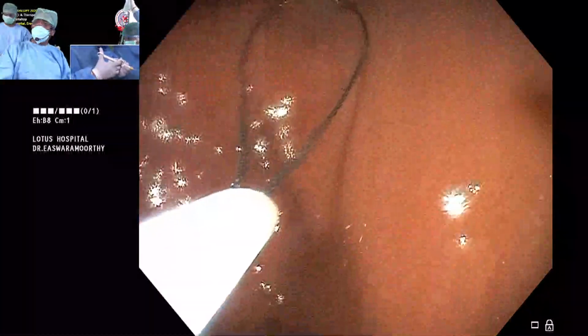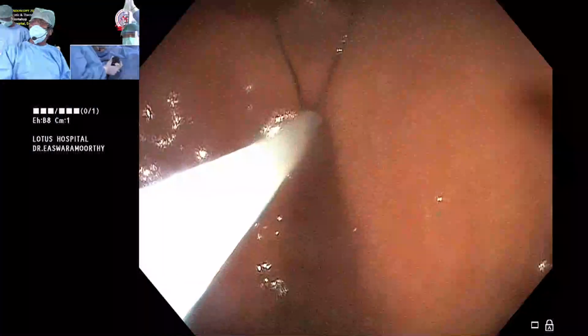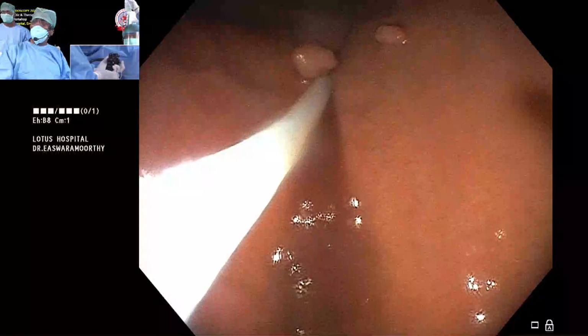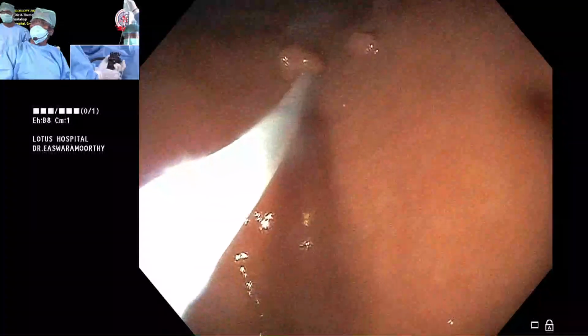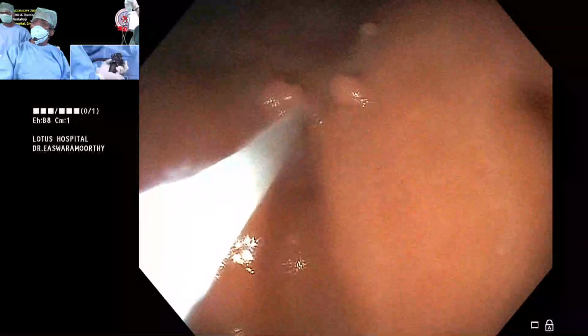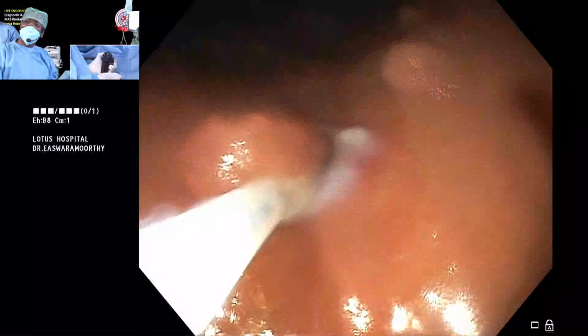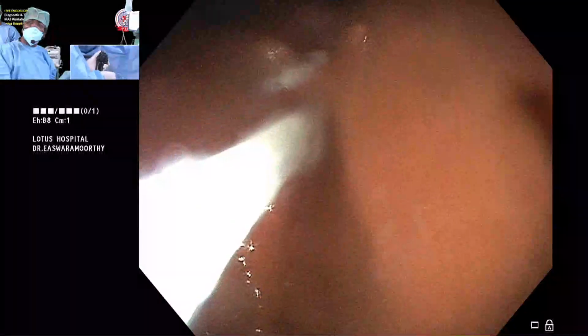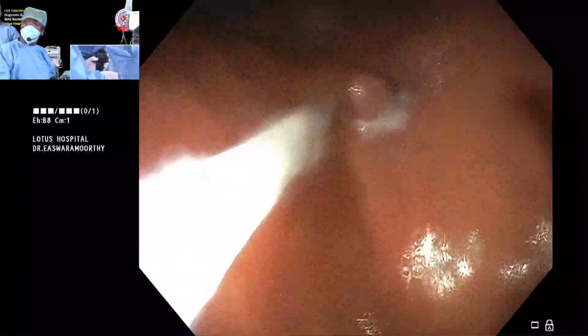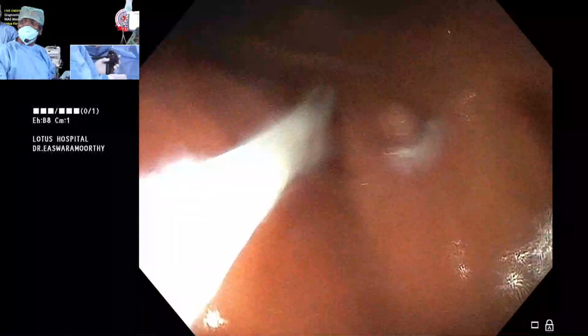And as you open, you see what's happening, see, engaged. So what I'm doing is, look at my hand, this hand, my other hand, I actually hug, close it now. Now see the mark, she has closed up to that, then again I lift it. So we have removed that also, okay.